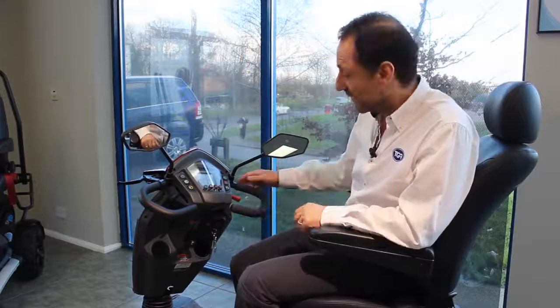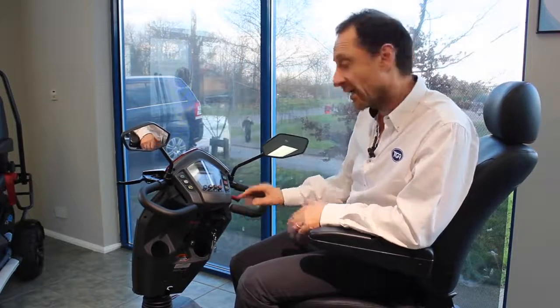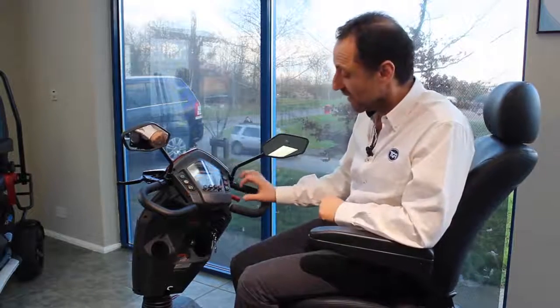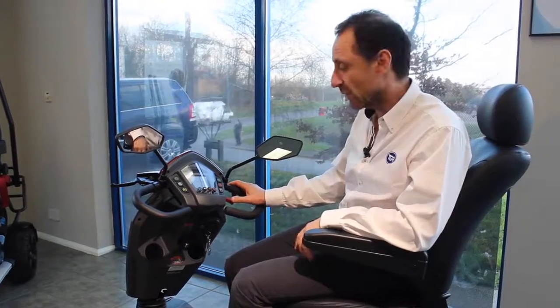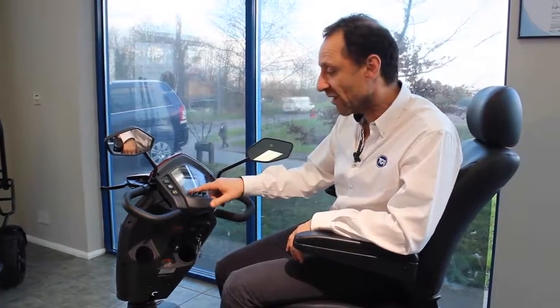All the Vitas have got a delta hand control, which means you can either drive it with your thumb or with your finger, and also from both sides. The throttle is very sensitive and very easy to operate as well. All the buttons are very tactile, very easy to operate, so you know whether they're on or off.